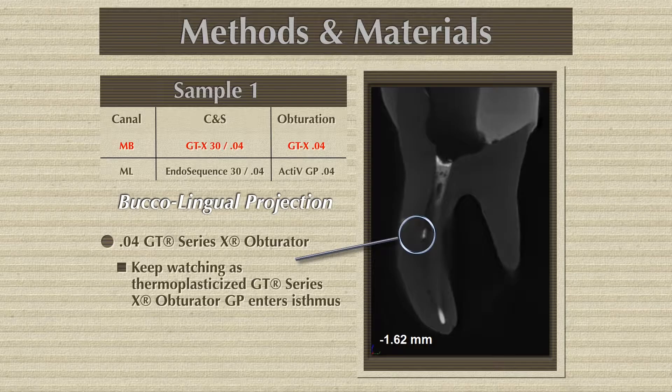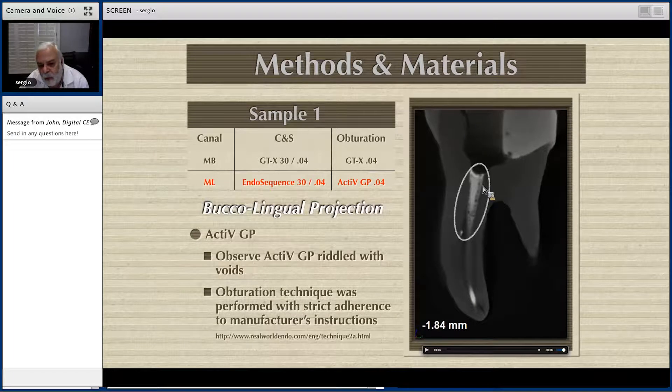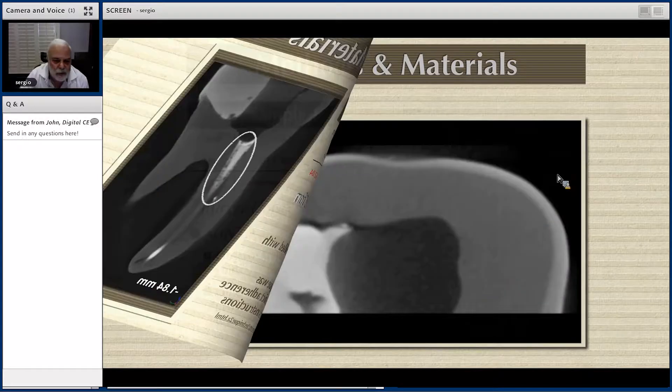Now, my dear friends, here comes the EndoSequence with the single cone technique. You can see the single cone and then all the voids. This canal is full of voids — full of voids. You are going to say, look at the voids that are on the coronal portion. This is the buccal-lingual view.